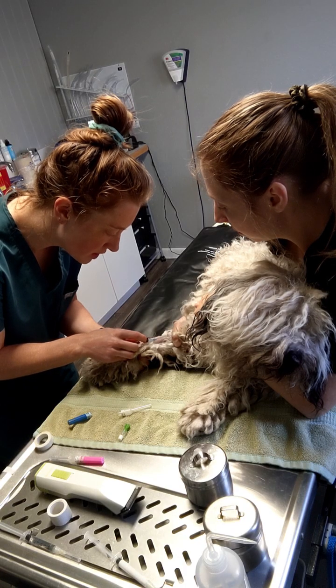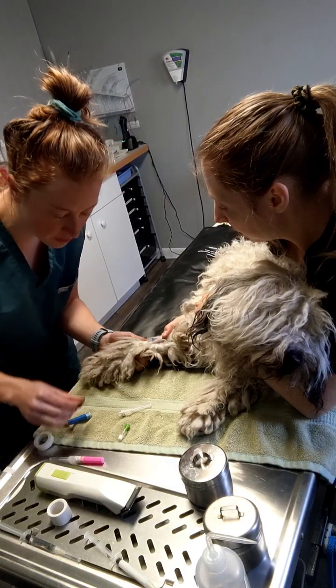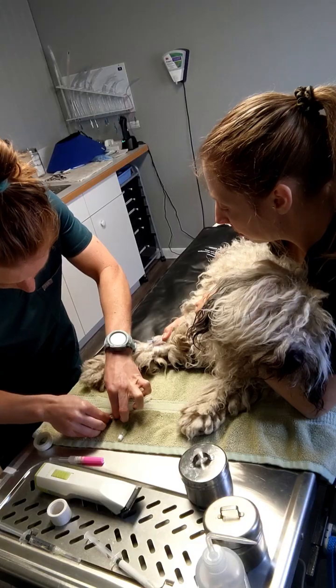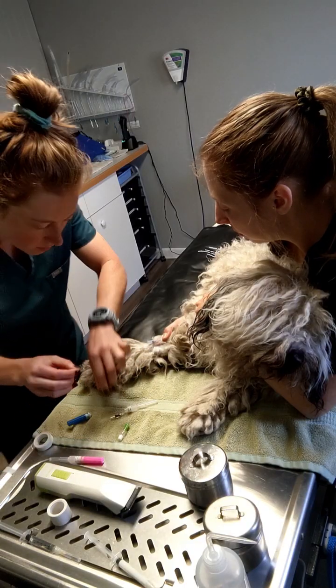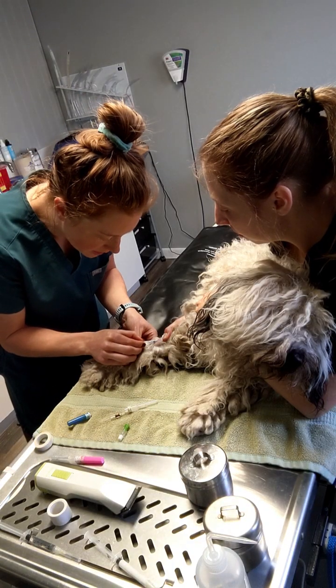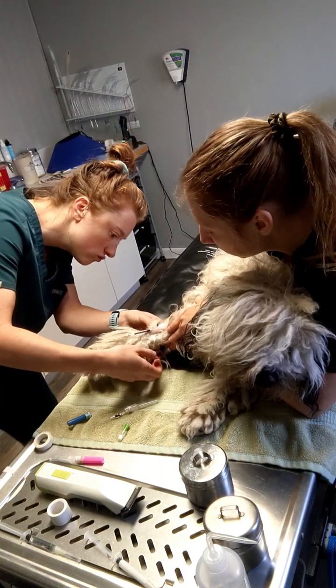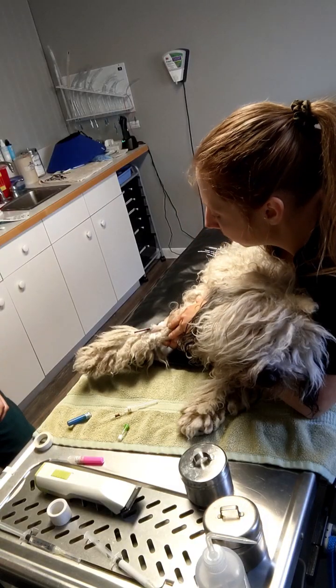The catheter should slide in fairly easily once I get a flash. Add on the cap while I secure it. Actually, I might go back with the short one like you did.